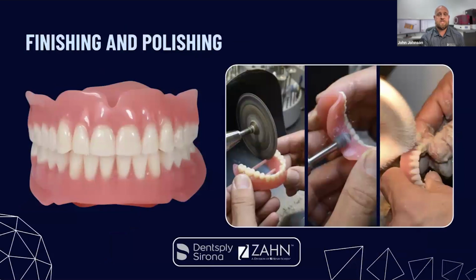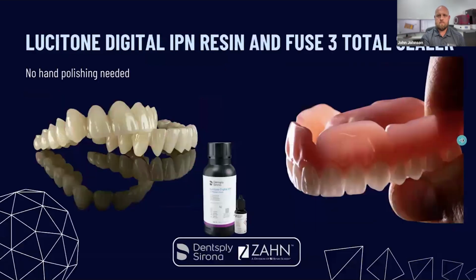And then with this material, even though the preferred option is to paint it with that Step 3, you can use a traditional pumice and polish if you'd like. You can see in these photos he's removing those supports. Like I said before, you've got to have those supports all the way through the curing process, and that ensures the print quality. And these are images of that Fuse 3 all over. You can see the characterization on those denture teeth. You can see the sheen, and I tell you, this stuff holds up. It's really nice.